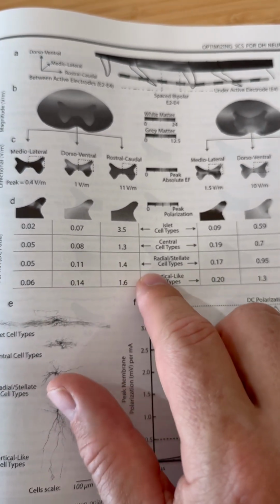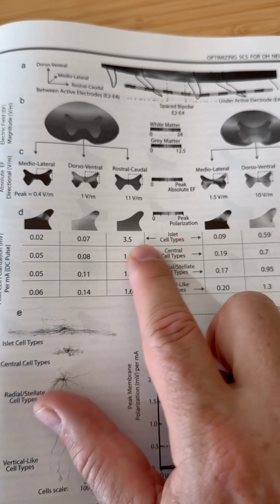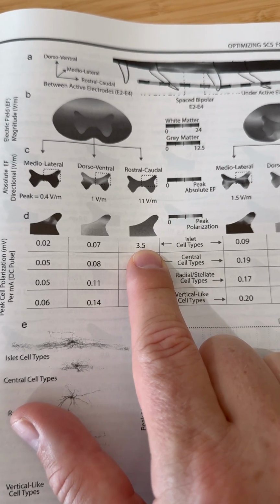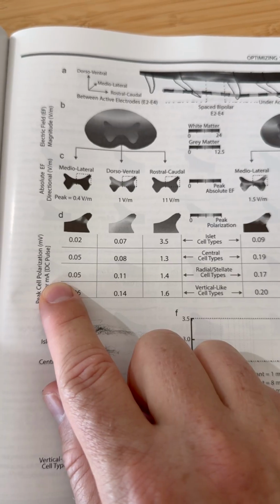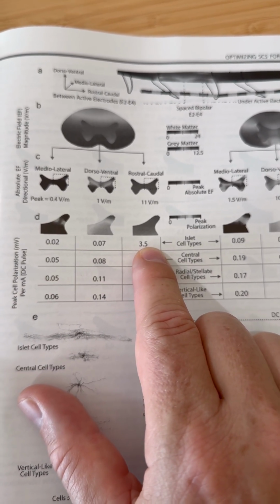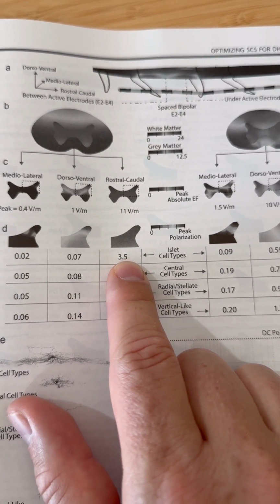And what we found was that these islet cells, basically by virtue of how large they are, polarize the most. So this is 3.5 millivolts maximum polarization per milliamp applied. So 1 milliamp would produce 3.5 millivolts of polarization, while 2 milliamp could produce 7 millivolts of polarization.